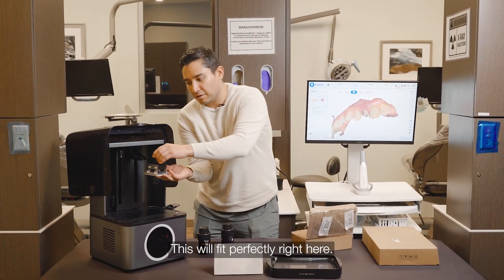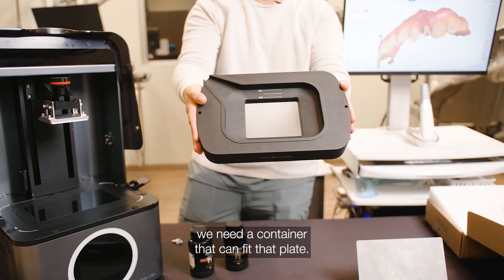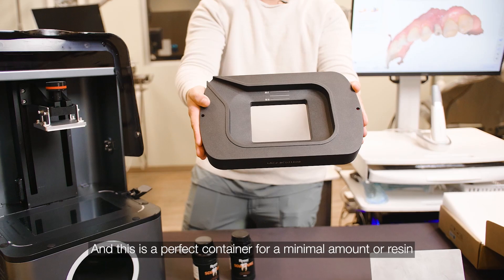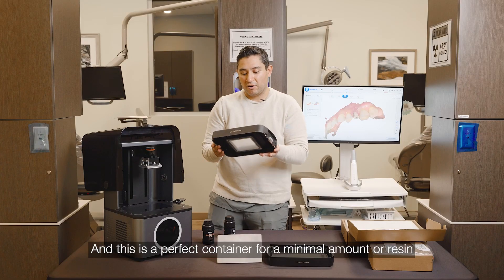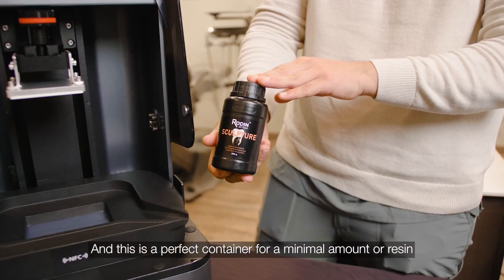This will fit perfectly right here. And of course, we need a container that can fit that plate. This is a perfect container for a minimal amount of resin as such.